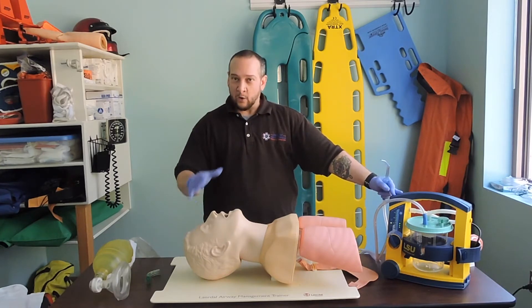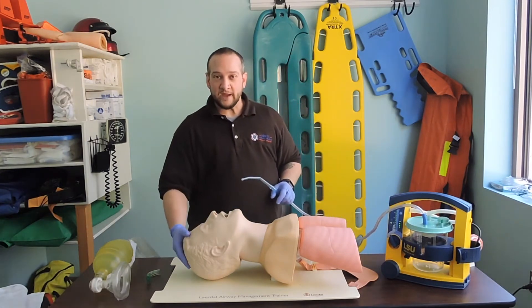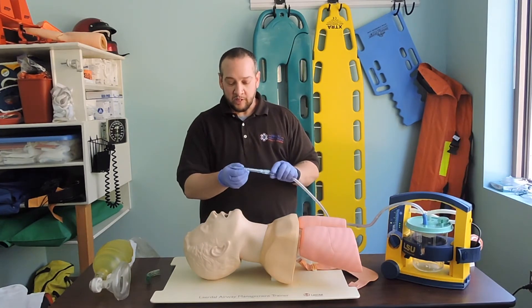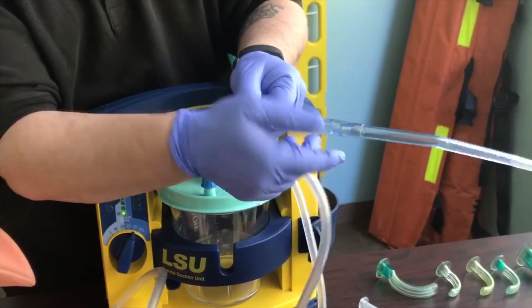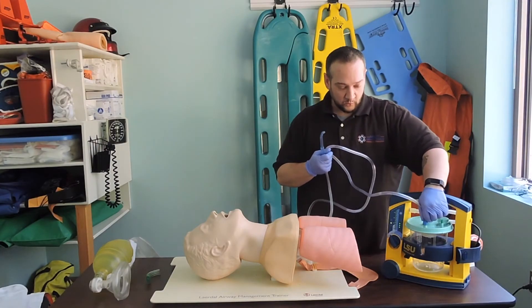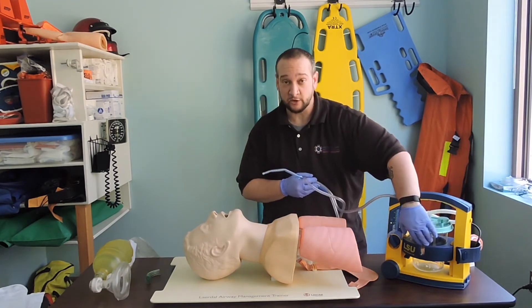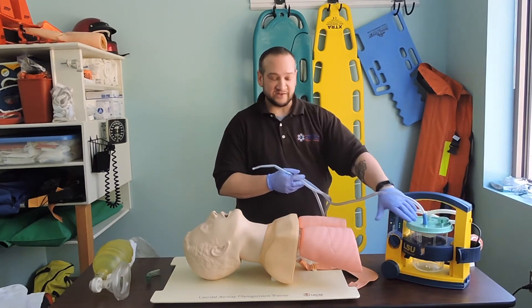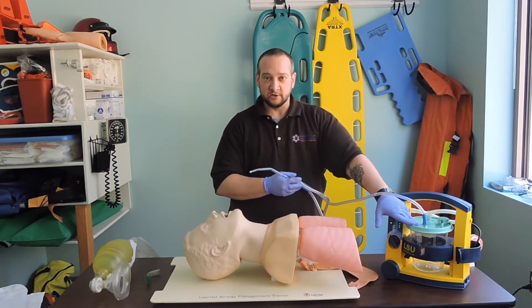For an adult airway, I'm going to use my Yankauer tip — a hard plastic tip with a little thumb port. The thumb port needs to be covered to activate the suctioning vacuum device. This connects to clear tubing, which connects into our collection device where everything suctioned from the airway gets collected. This is always disposed of in a biohazard waste materials section — not thrown into the trash, not dumped on the side of the road.